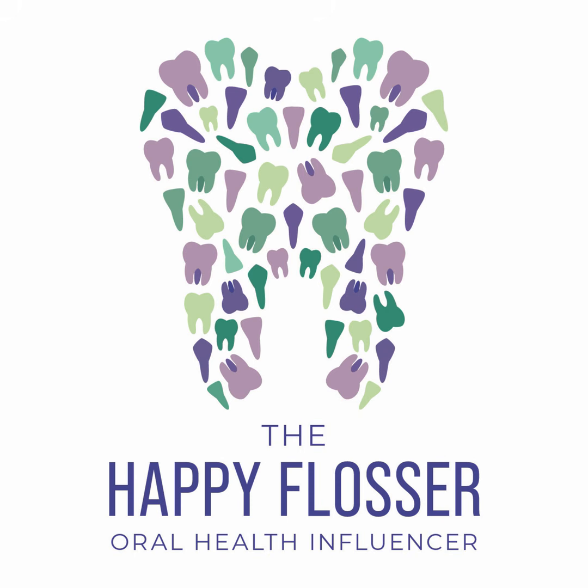So what's important for you is to note it. Note that you saw something, ask the doctor about it, document your findings, and have that conversation with the doctor when they do that exam so that you can work together to be sure that all of the things are reviewed with the patient.